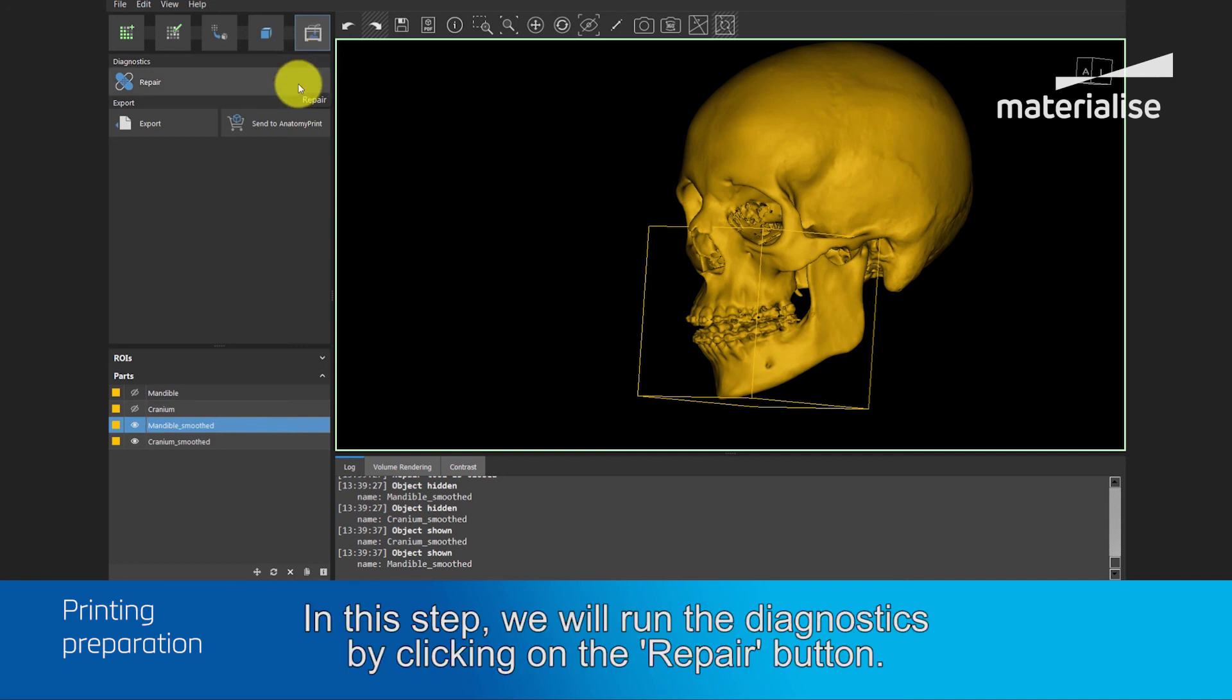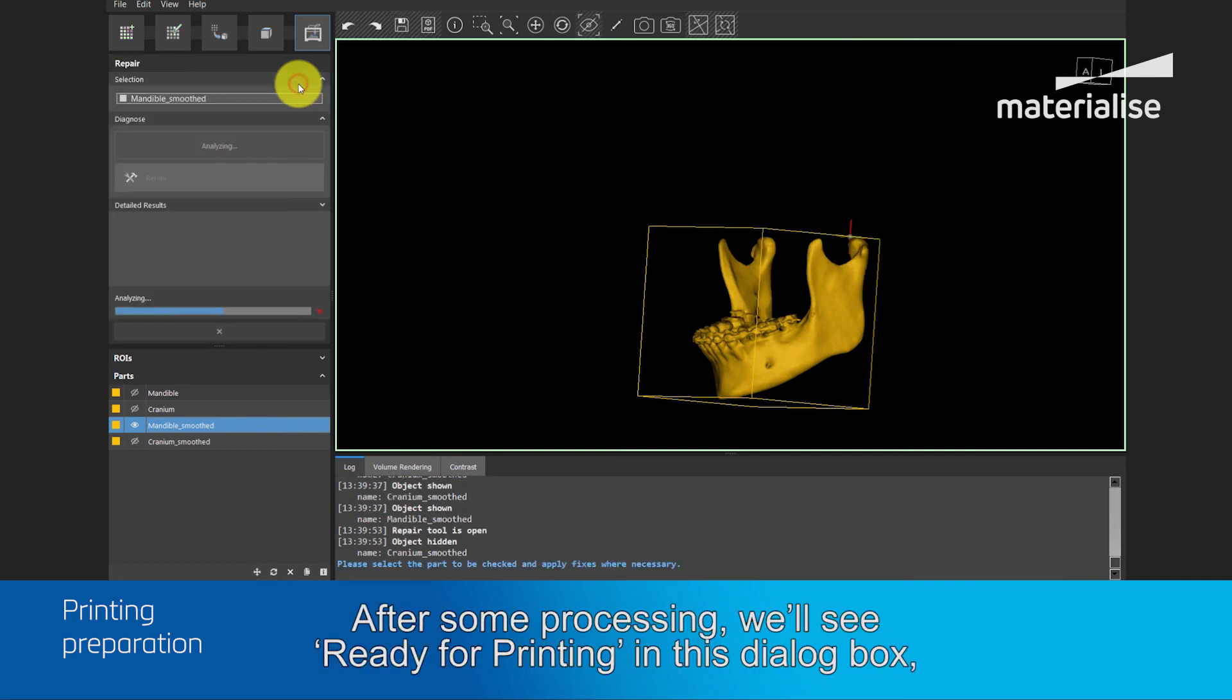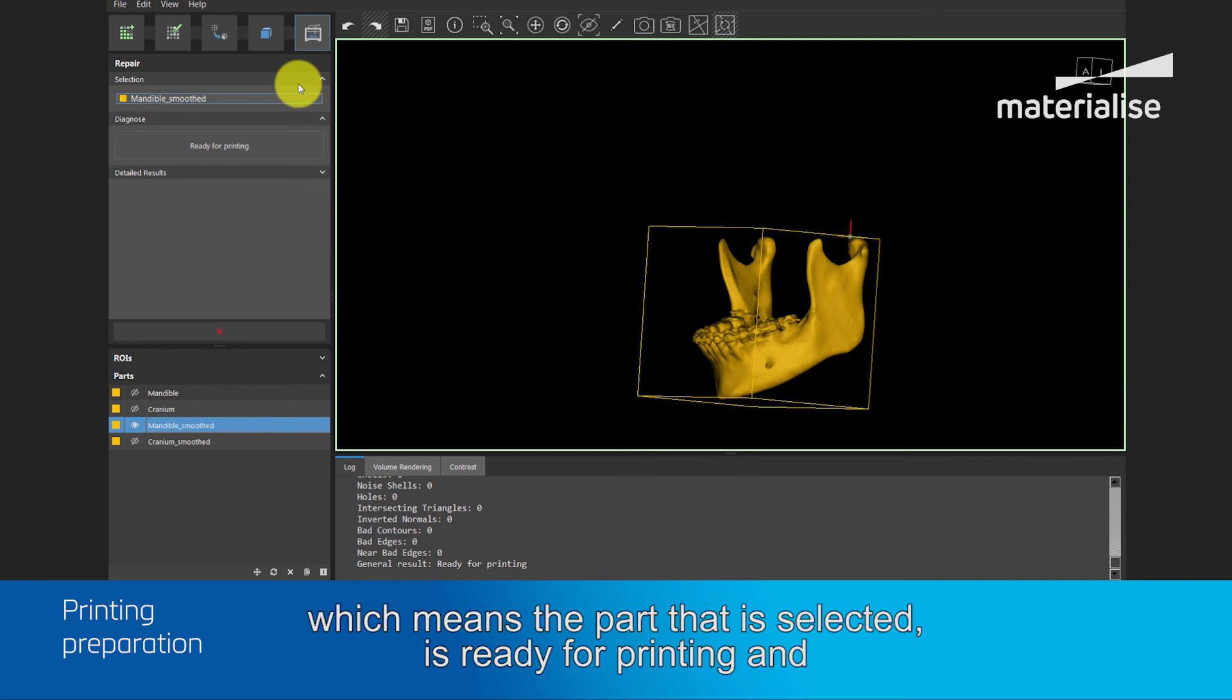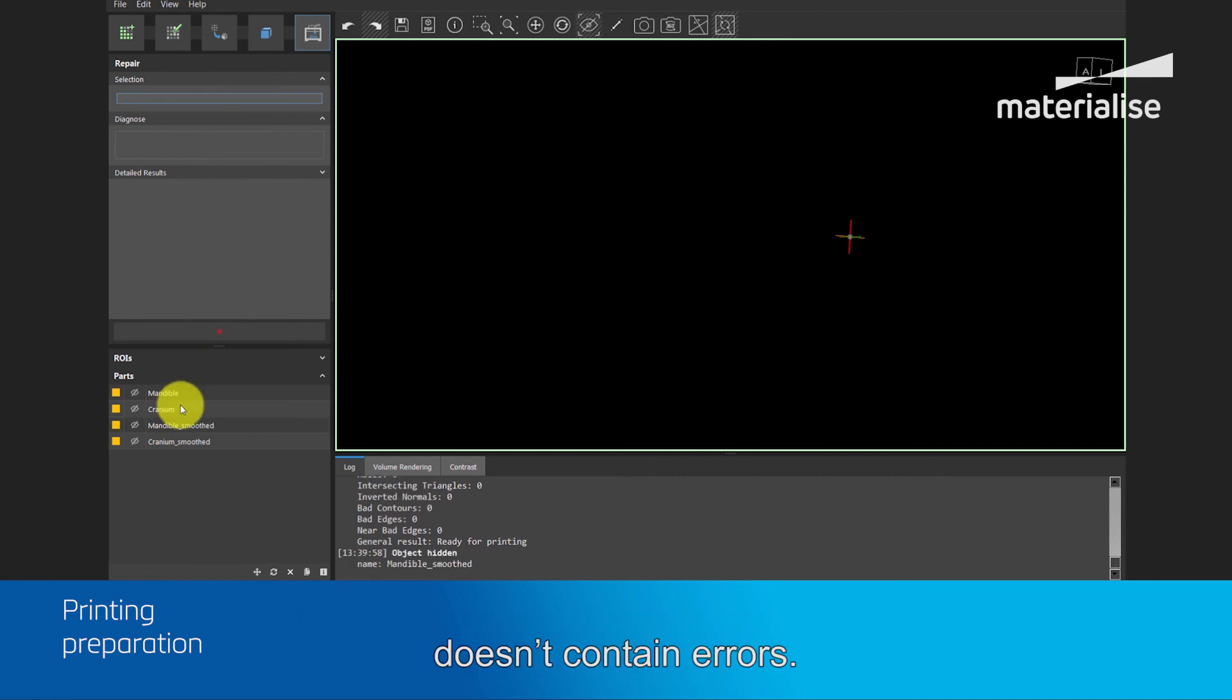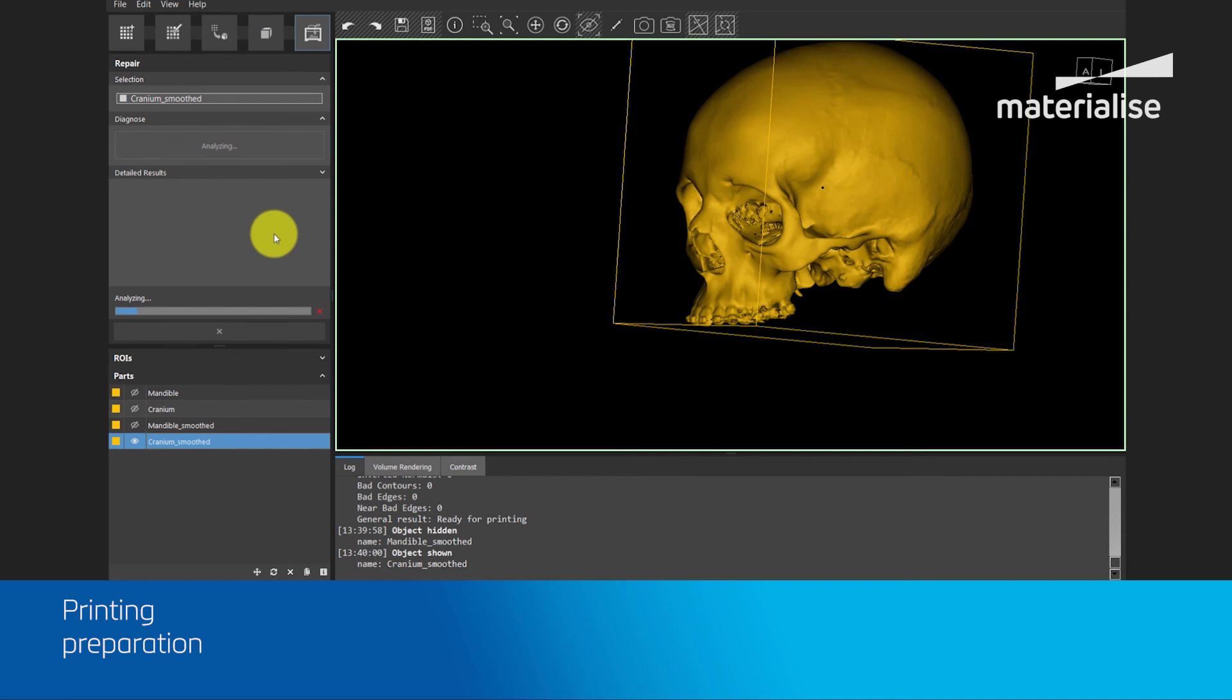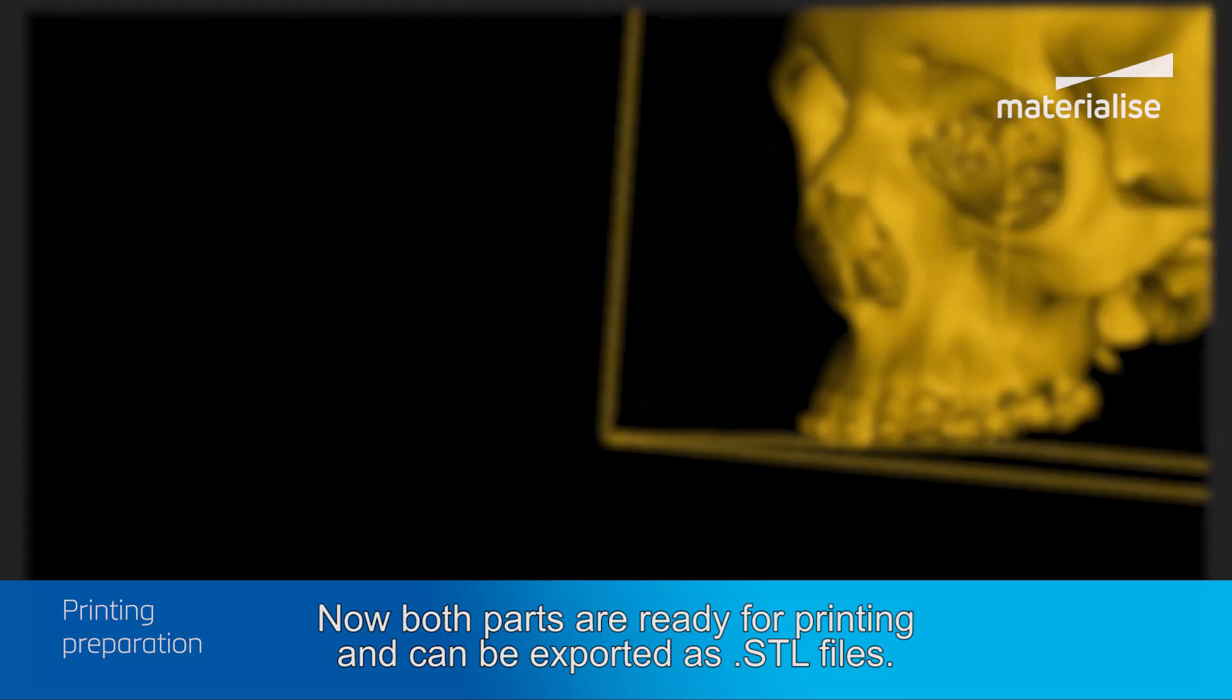In this step, we will run the diagnostics by clicking on the Repair button. After some processing, we will see Ready for Printing in this dialog box, which means that the part which is selected is ready for printing and doesn't contain errors. We will do the same for the cranium. So, now both parts are ready for printing and can be exported as STL files.